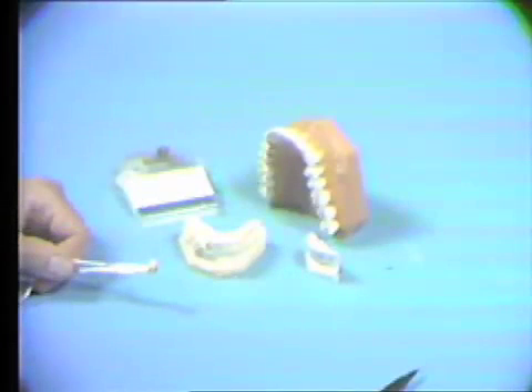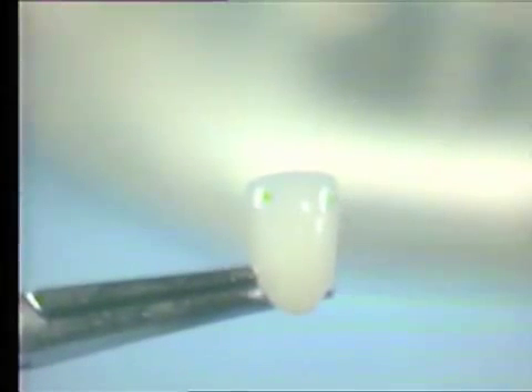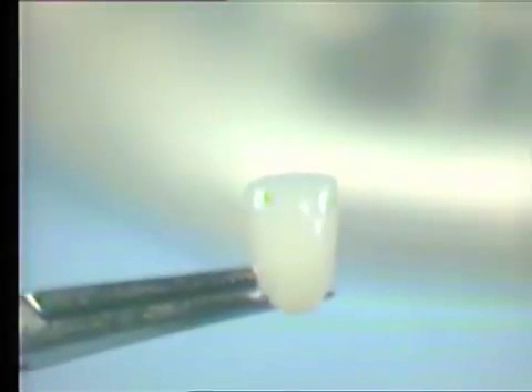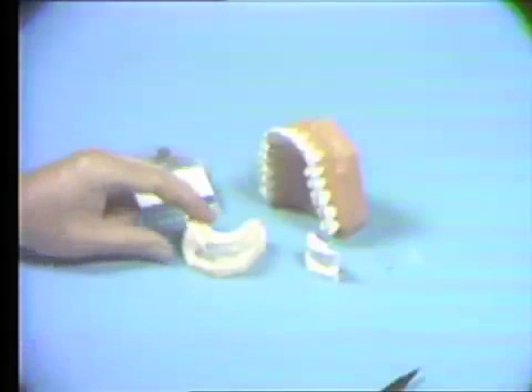There are several considerations in grinding ceramics. It is a glass-like material and therefore must be handled with a degree of caution. Also, cleanliness is of the utmost importance, for a small speck on the surface will appear highly magnified after the restoration has been glazed.